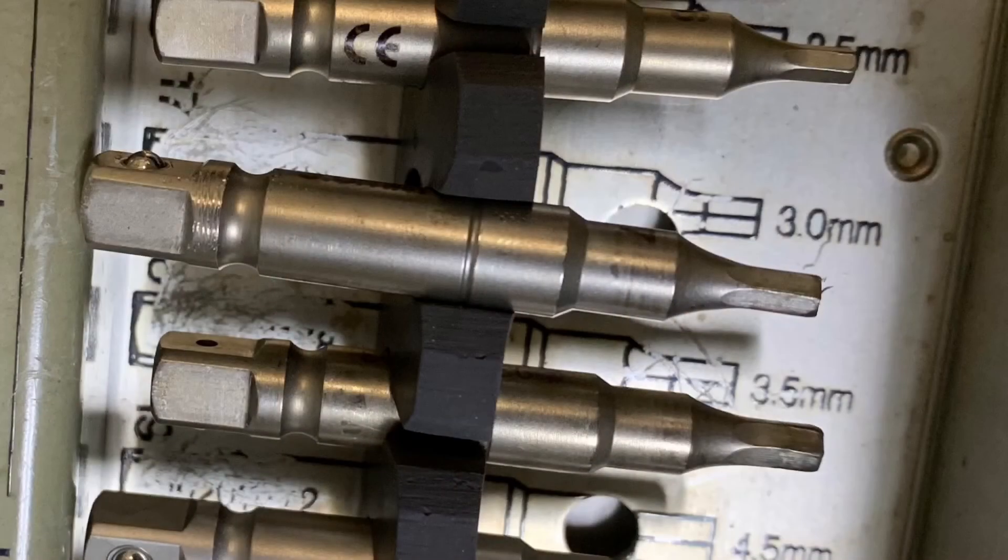The inner portion of the screw is a hexagon, and in the Synthes spinal screw removal set it's a 3.0 millimeter hexagonal screwdriver. Usually this is the most difficult part of the screw to remove. Again, 3.0 millimeter hexagonal screwdriver.